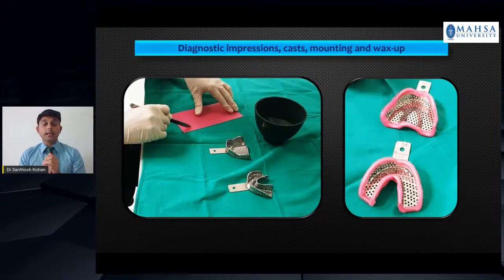Especially in cases where the patient has a lot of proclination or a long edentulous span somewhere with other remaining natural teeth, it is very difficult to seat your impression trays. You might have observed that already. So when you bead the tray with the modeling wax, it allows you to adapt the tray or customize the stock tray to the patient's mouth. So just use a bowl of warm water, soften the wax, cut it, and bead it all around the tray. It doesn't really take a lot of time. So especially in cases where you have a lot of proclination or a lot of malalignment of the teeth, once you bead the tray, you can in fact dip it in warm water and just mold the wax in the patient's mouth before you actually do the impression. So you can exactly customize the tray in the patient's mouth and then do the impressions.